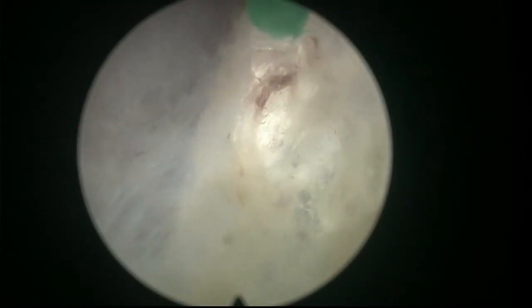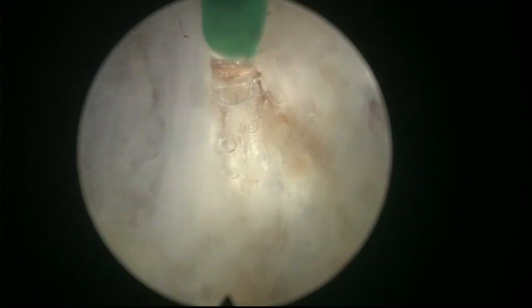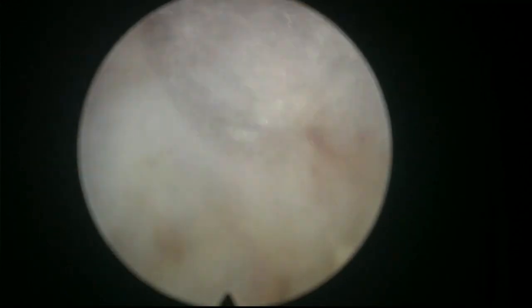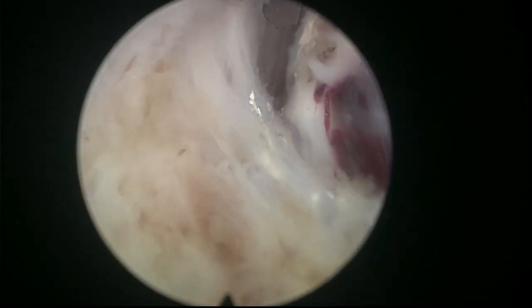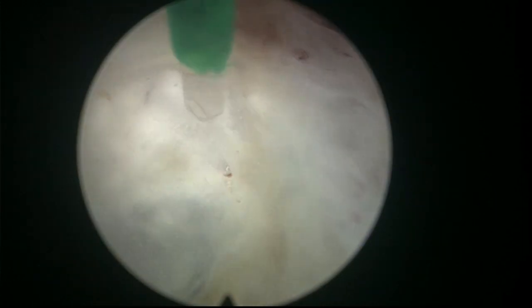Yeah? This is normal. We don't see it in the three lobe technique because actually the cut of the side, 5 and 7 of the side of the middle lobe comes exactly in this area. So it's the first time we see it when we do en-bloc enucleation. It took a while to understand what was going on, why we would see that apparent discrepancy in the dissection plane. So here we are also progressing towards the bladder neck.